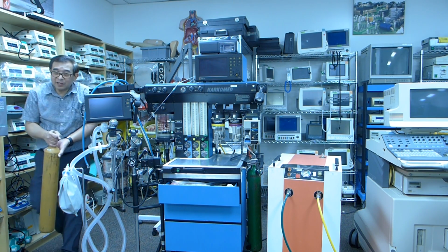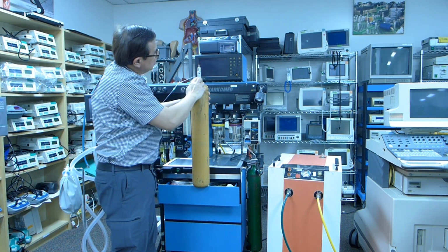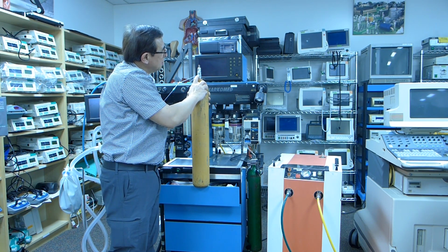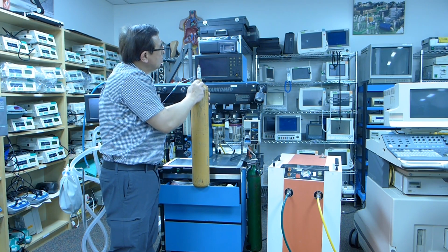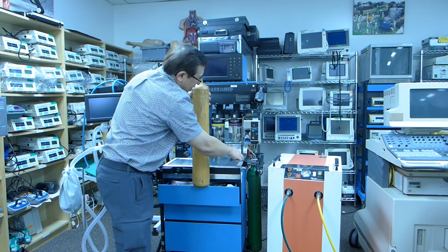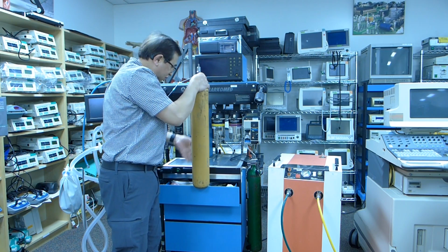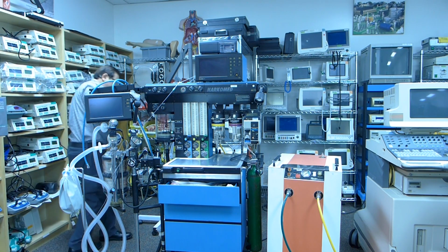The other thing I want to point out is this hole here, the pin index. It's a safety system where you have a different position for each different gas. So we can't put this on the oxygen yoke. This is the oxygen yoke. You get two of them, so you can put two oxygen tanks there. They have only one air tank, so this is a different configuration from the oxygen. This can only fit that air yoke.